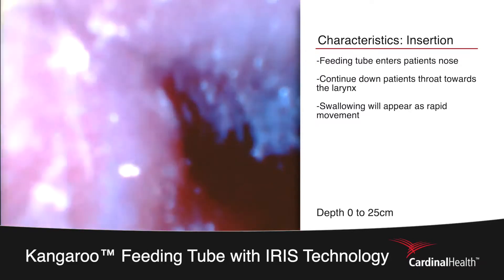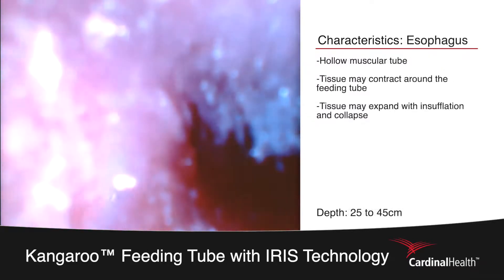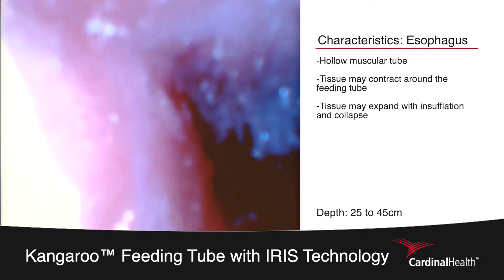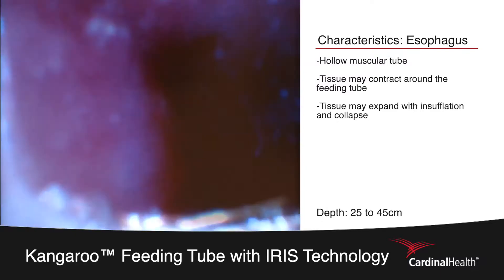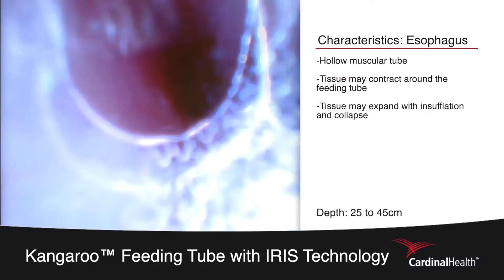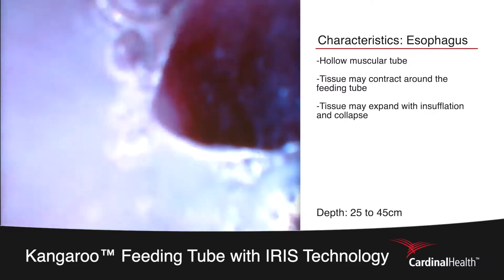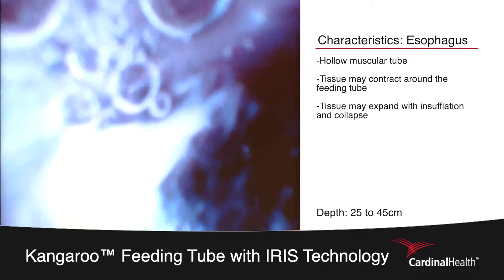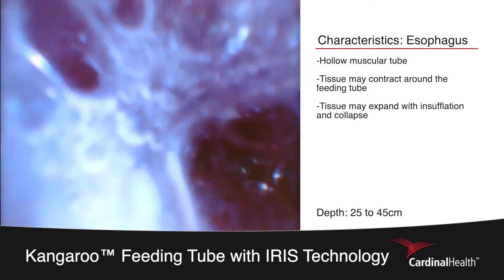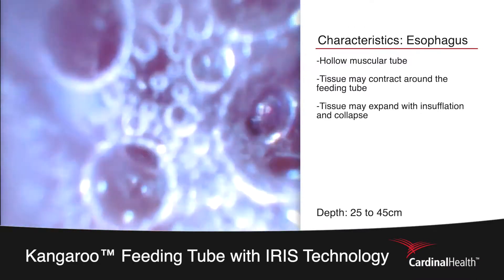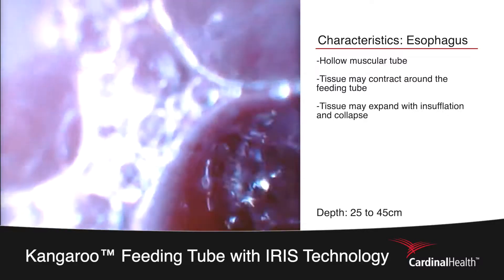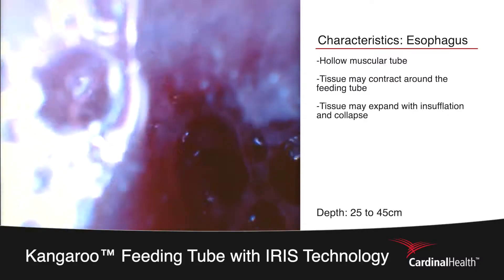The placer then progresses down to around the 30 centimeter mark where we will pause to ensure that we have moved into the esophagus and the top of the GI track. The esophagus is a long, hollow, muscular tube, collapsed in nature, as can be seen here on the screen.